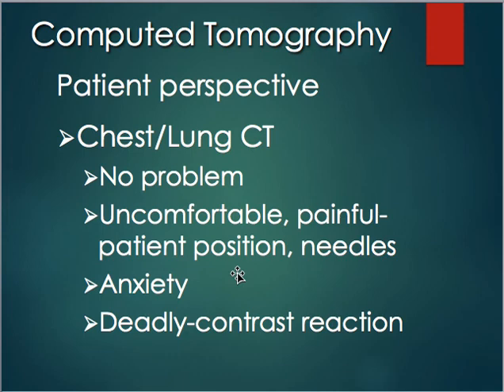The patient's perspective, again, is usually no problem. Some facilities don't even require the patients to get undressed for these. Occasionally they can be uncomfortable or painful. If the patient's having chest pain, they may have difficulty lying still or lying on that hard table. They may also have a problem with the needles. That can be painful again when we start the IV for the injection.